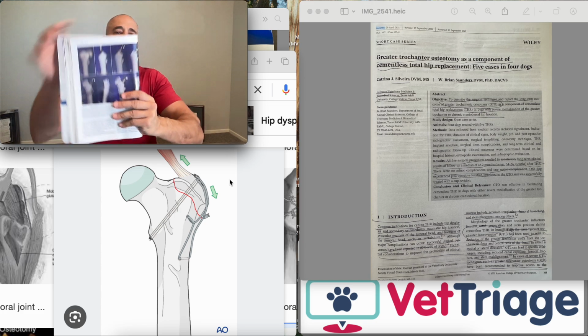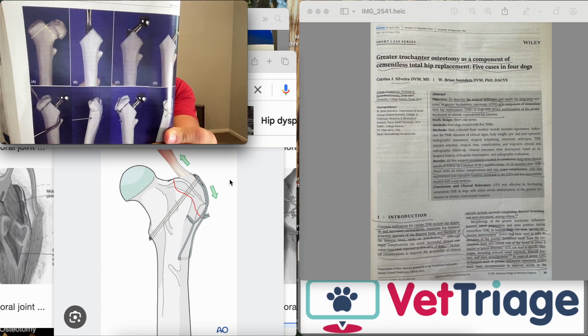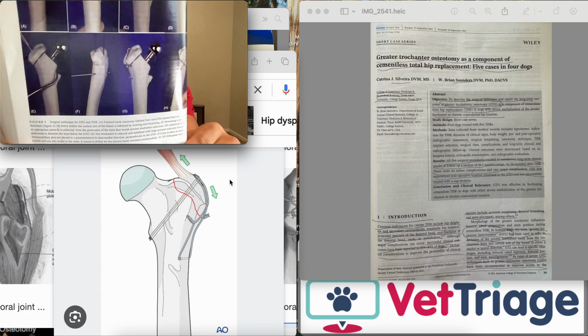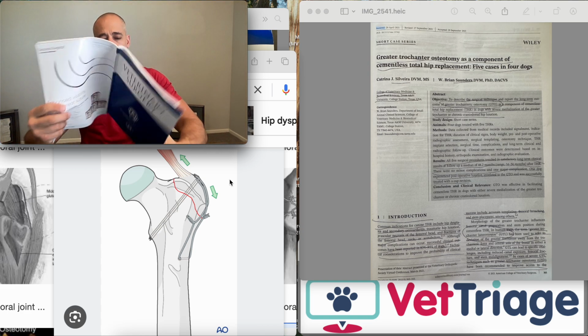Here's a model of what they're doing. So you can see the top row, they did the femoral head neck ostectomy, the greater trochanter osteotomy, they placed the total hip replacement implant, and then once they're done with the implant, they replace the greater trochanter and stabilize it with the pins and tension wire.